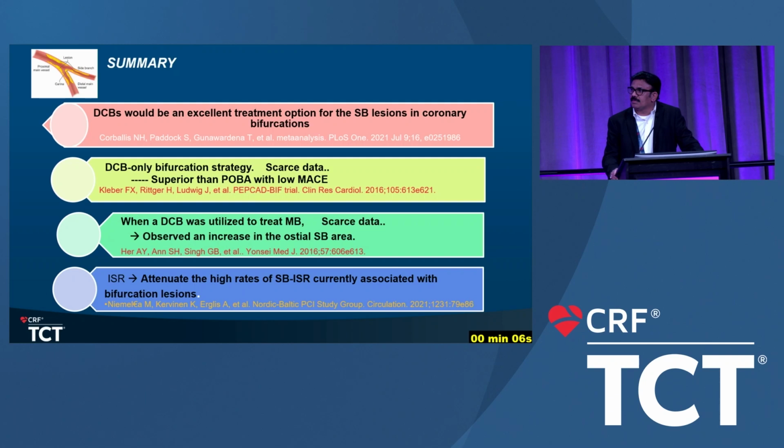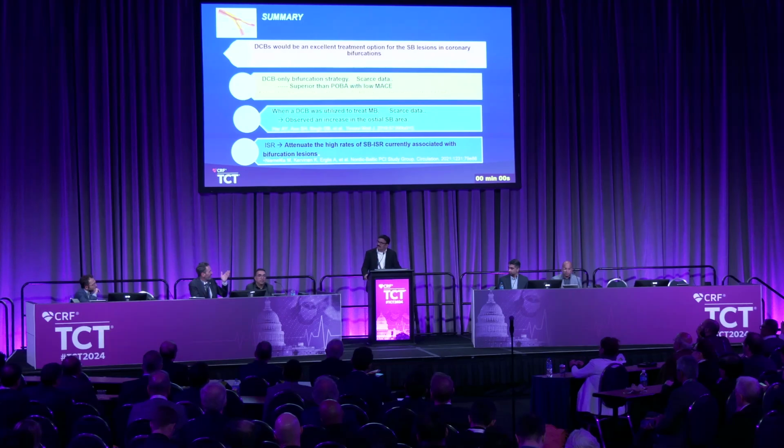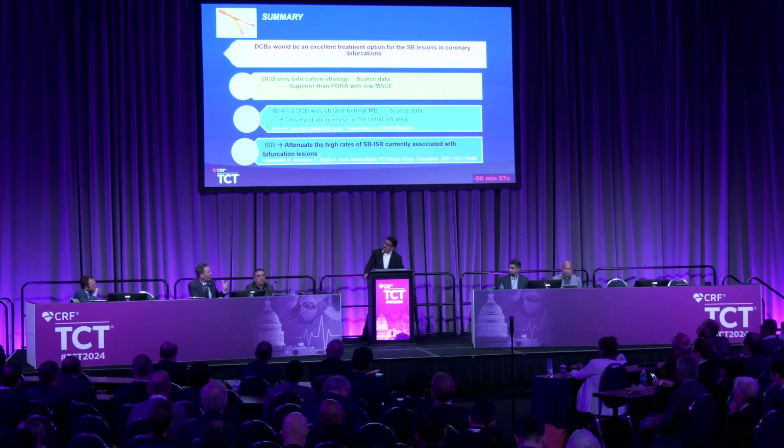Yeah, I would like to comment on the fact that all of these cases have been done with intravascular imaging. So they were ISR management guided by intravascular imaging, which is, in my opinion, the way to go. And I wanted to ask you and Azeem also a comment on how important it is to use intravascular imaging for the MAGICAL ISR study. Which are the recommendations and all of that?